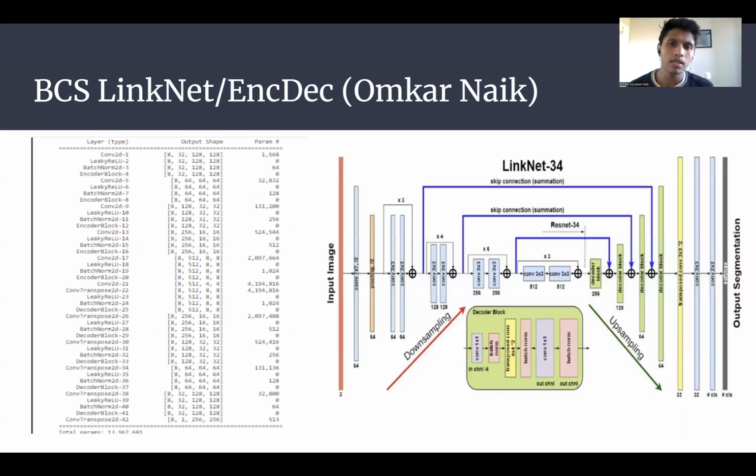So the main reason for using LinkNet was it utilizes the parameter really well compared to the other algorithms. So here we can see the layers of encoder and decoder. Encoders are used to extract features, where here in the algorithm I'm using something called backbone, where backbone are like ResNet or VGG based algorithm, and they are used in the encoder. And then in decoder we use pixel classification where we segment the tumor-based cells, and we can see that input image and the output image size are same. With the help of upsampling and downsampling, it keeps the size same.